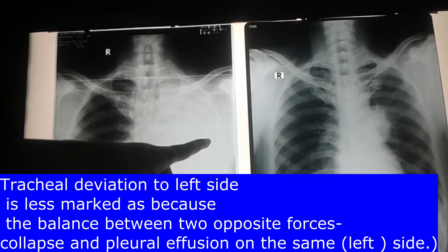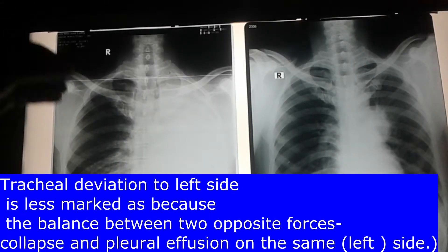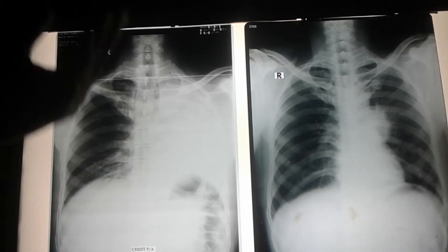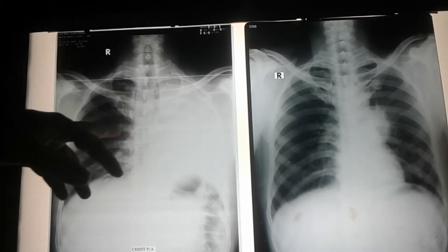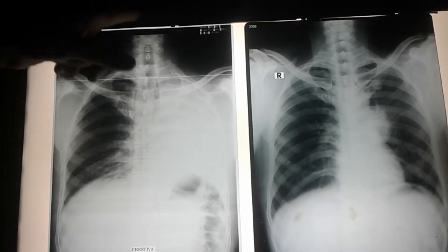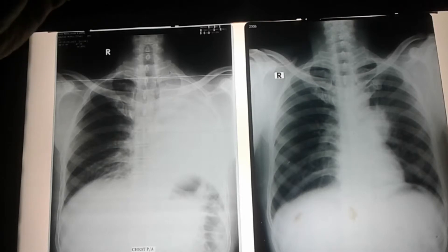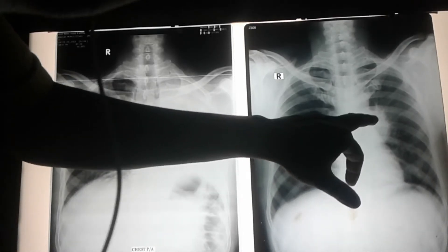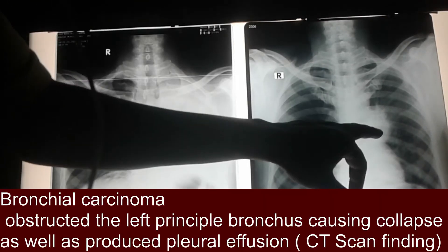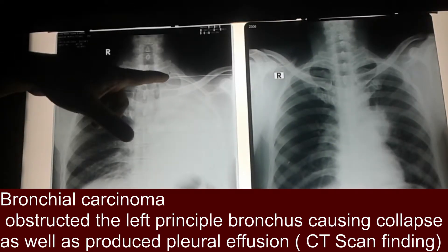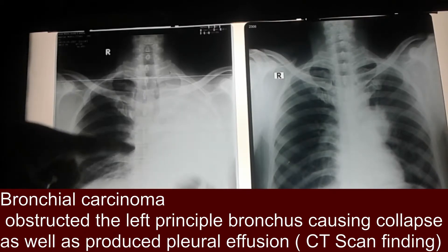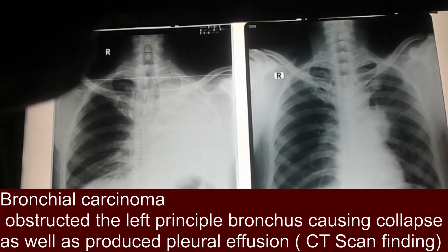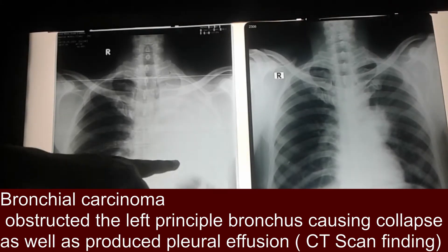This left-sided lung collapse is compensated by pleural effusion on the same side. Because of this balance between collapse and pleural effusion, the mediastinal shifting and tracheal shifting are not so marked. Interestingly, both the collapse and the pleural effusion are caused by the same single malignant lesion located here.